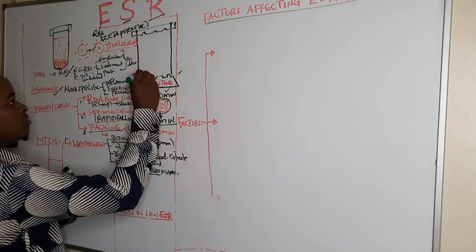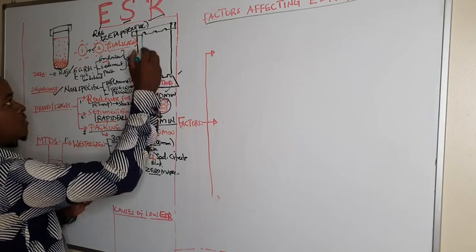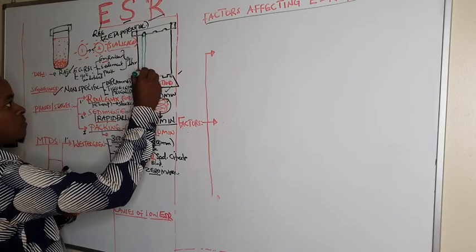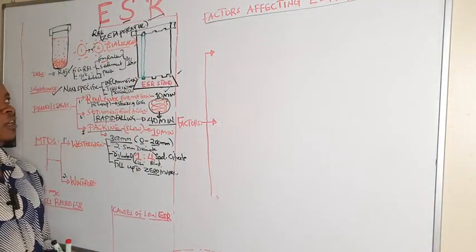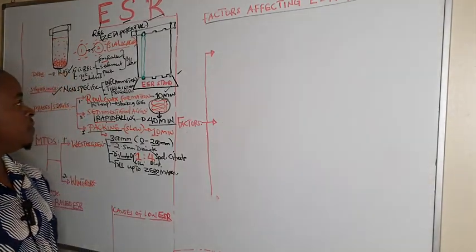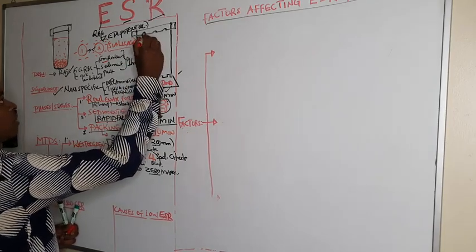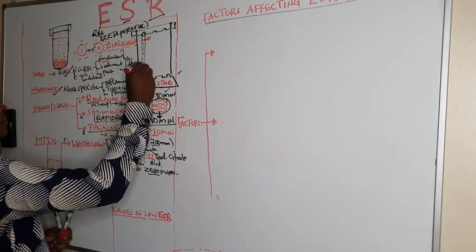So this is the tube where we have filled the blood. It is placed on the ESR stand on a horizontal bench, vertically, that is at an angle of 90 degrees without bending. If this is the 0 mark, you fill blood up to the 0 mark.